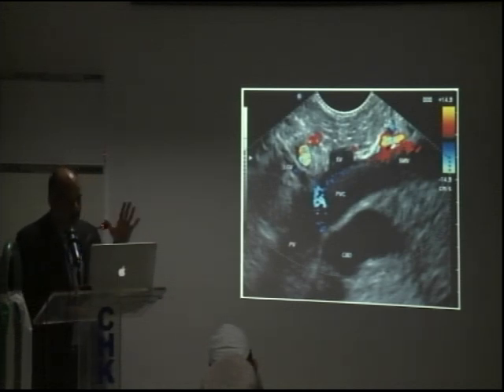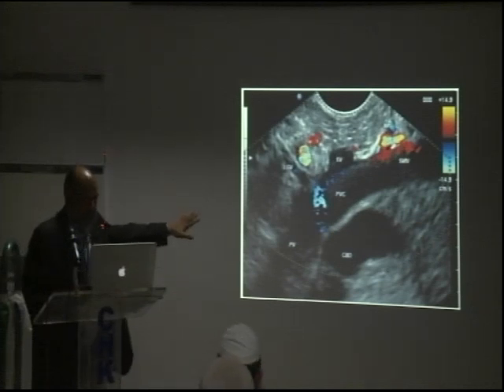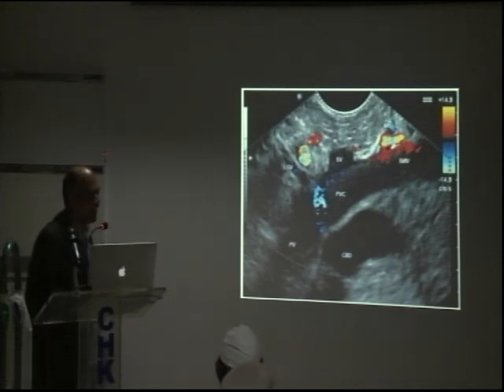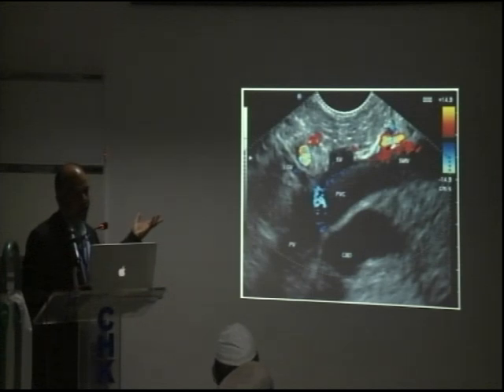So the idea is to tell you that you have to learn it yourself. Identify the structures. Don't try to fit the template on that. You see, your template is just reversed here. Even if you label it that way, it should remain the portal vein. If this is not the portal vein, you can get the same image from the stomach. If the labeling is removed, then you see. So I'm just trying to make a point here. Identify the structures.